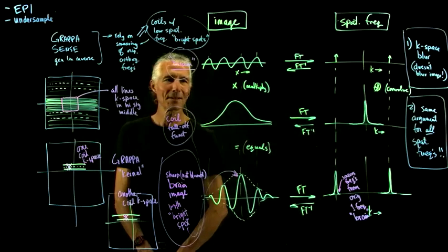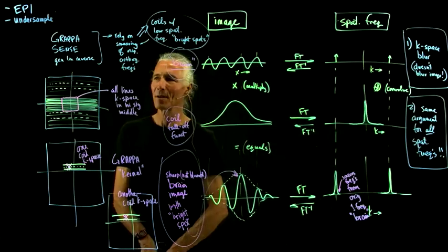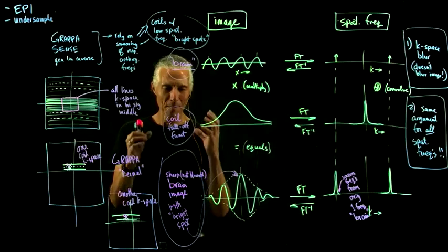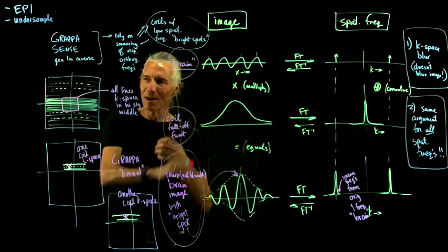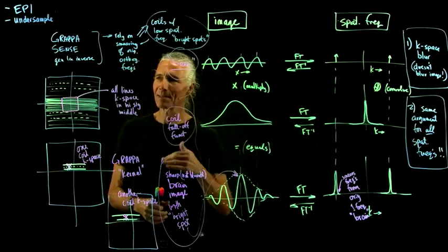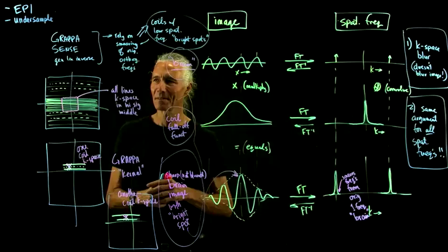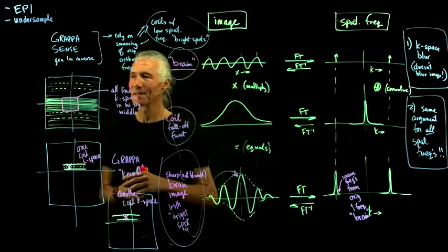Okay, any questions about EPI or GRAPPA? And so next time on Friday, we'll talk about multi-band, which is kind of applying GRAPPA in another twisted way to multiple slices excited at the same time, but it's kind of the same idea. Okay.